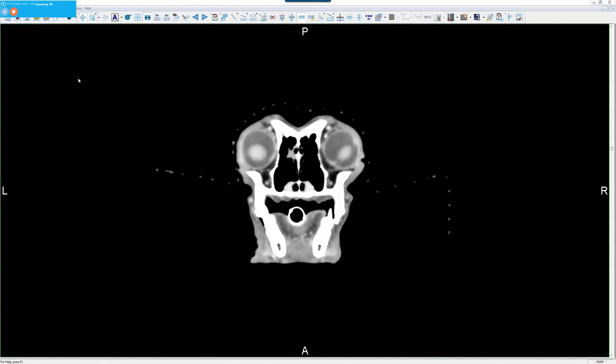of our patients get diagnosed and certainly a very critical part of preparing a patient for being treated with stereotactic radiosurgery. So this is the CT scan of a 12-year-old beagle who presents with a history of late onset seizures. So she had been a completely normal dog up until a few weeks prior to this CT scan when she started to have seizures. And that is a fairly common finding for us in the world of radiation oncology. When we have an older dog or cat that begins seizuring, tumor really is the first thing we think about.